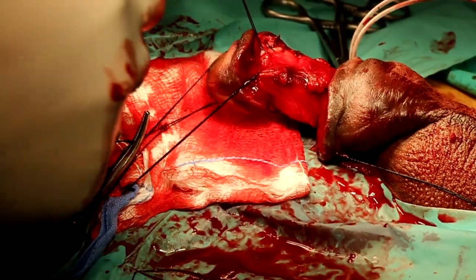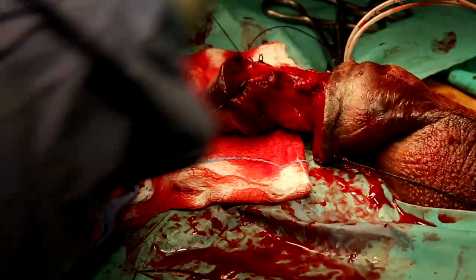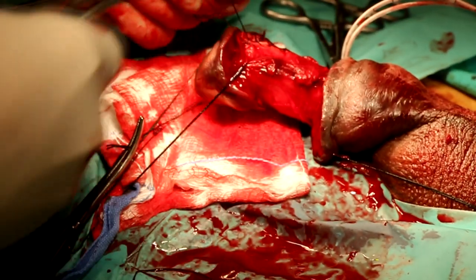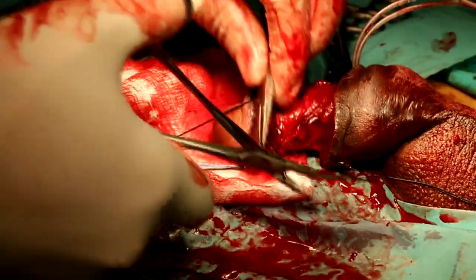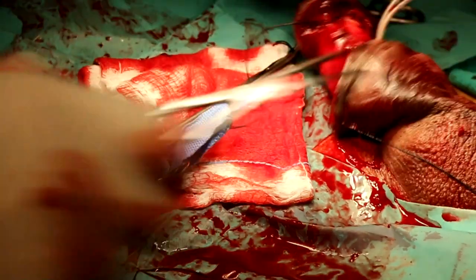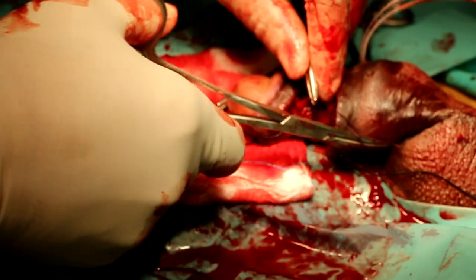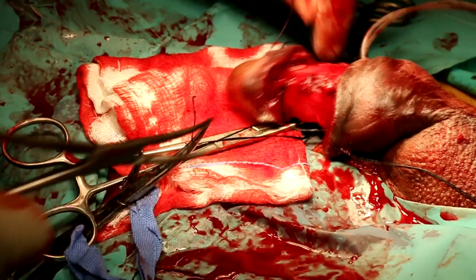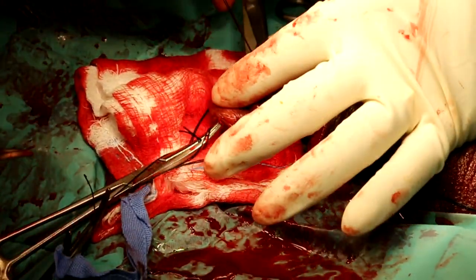Okay, so we have to close the tear completely. Now the tear is closed completely in a good bloodless field. So as I said, it is commonly unilateral. Most of the tears are on the right side, unilateral, in the proximal corpus cavernosum, and it is associated with injury to the urethra in just around 10%.